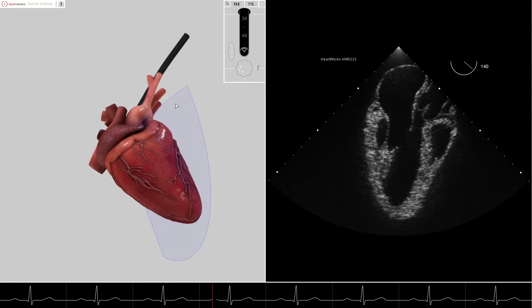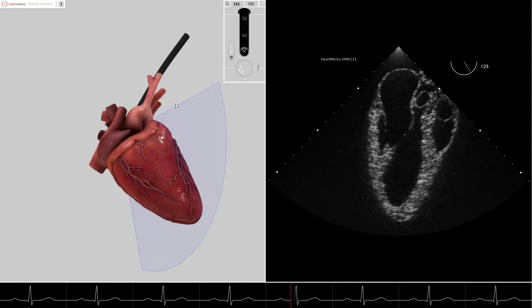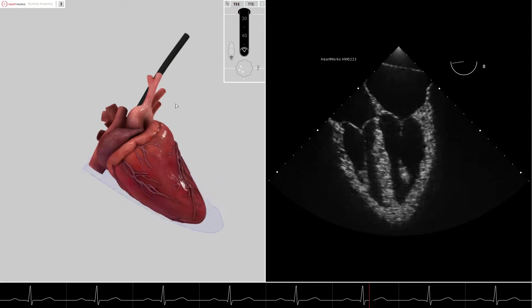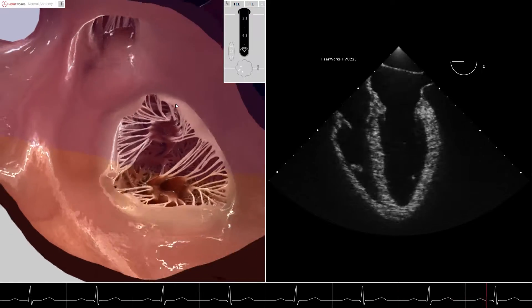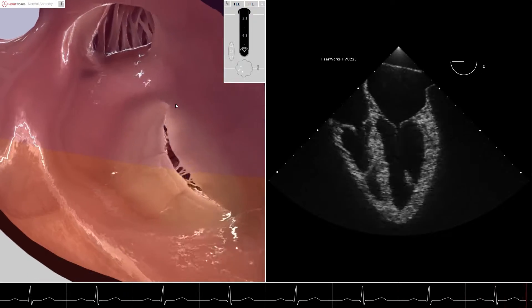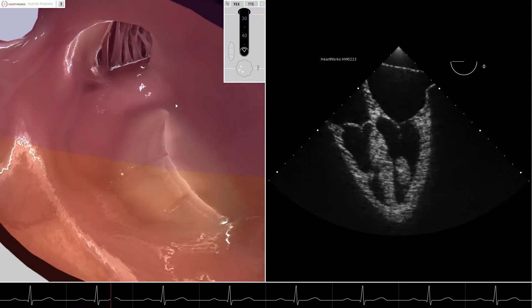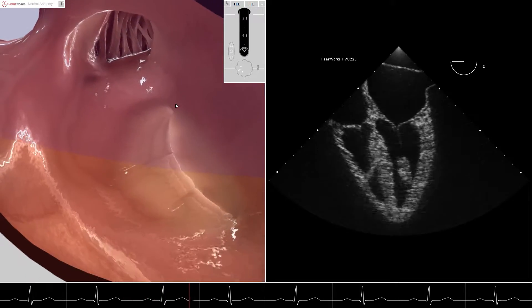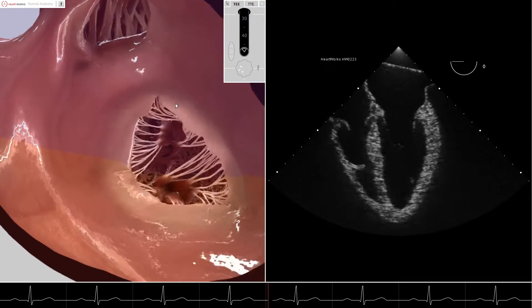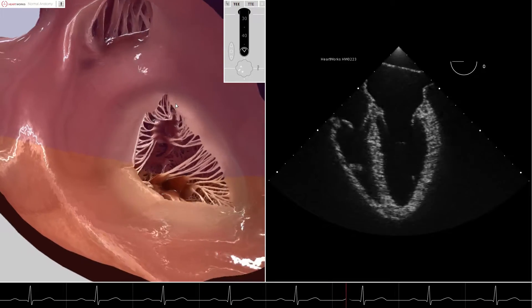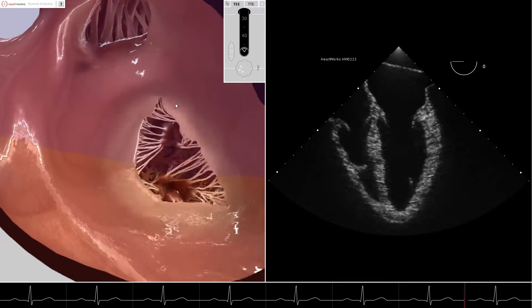Now that we understand the various positions of the omniplane, we return to the virtual reality view as if we are back in the mid-esophagus looking into the left atrium. We have an en-face view of the mitral valve as would be seen by the cardiothoracic surgeon when performing a left atriotomy for mitral valve repair or replacement.